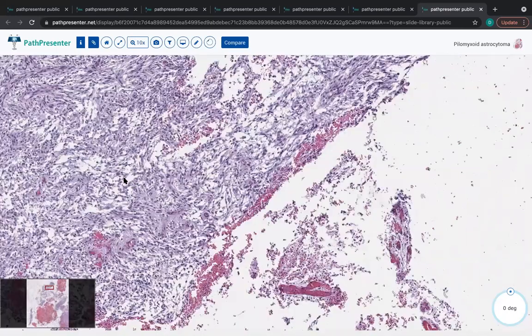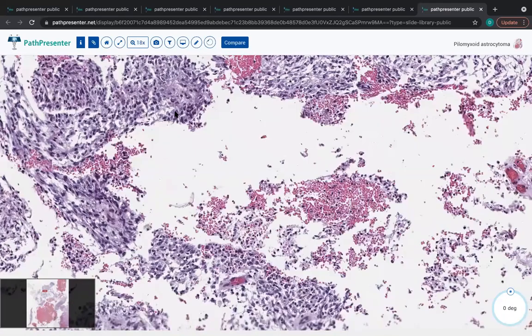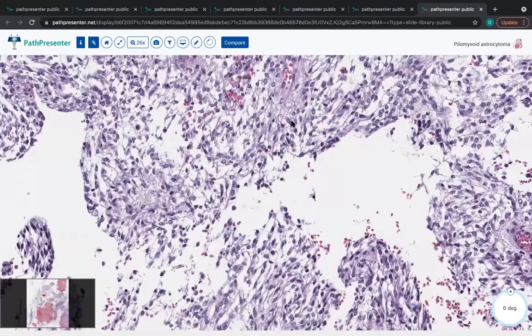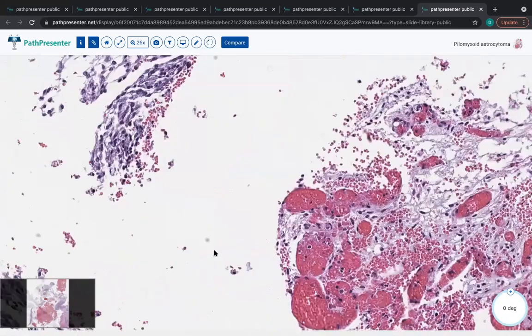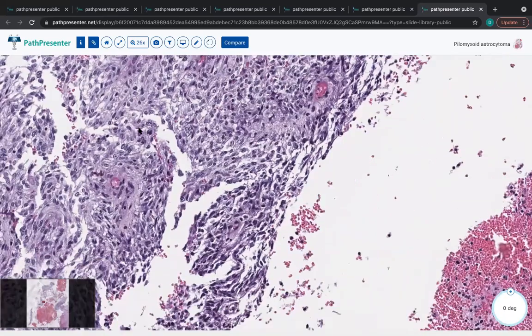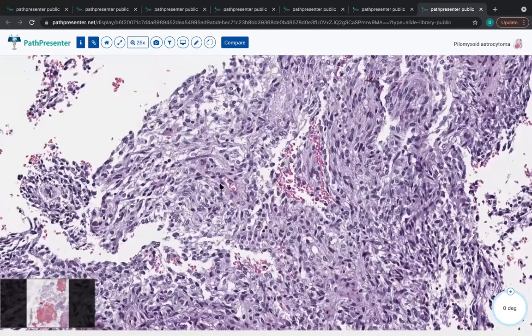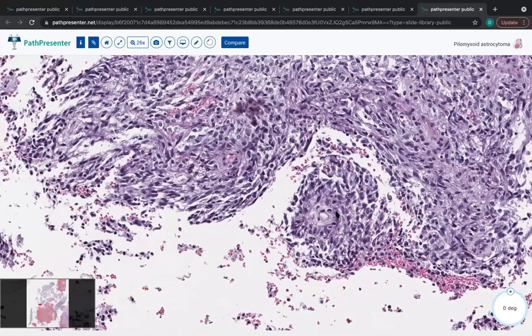But noticeably absent, we don't see the characteristic biphasic architecture. And I know we haven't had a chance to review the entire slide together, but you can take my word for it that there aren't Rosenthal fibers in this section. And so this would be, again, a glioma that has these, quote unquote, piloid features. They have pilocytes present, but not all of the features of a pilocytic astrocytoma. And when one does molecular testing on this, here's a good arrangement of the cells around the vessel here.